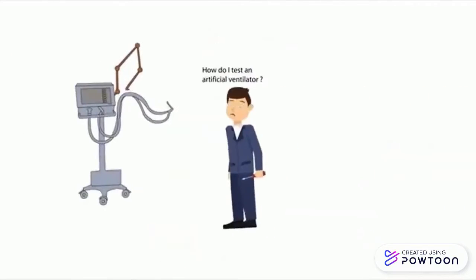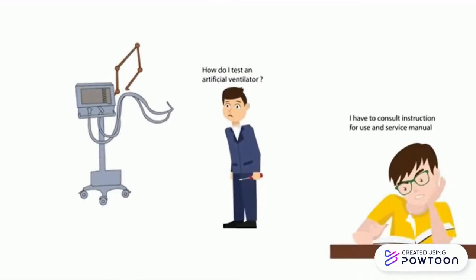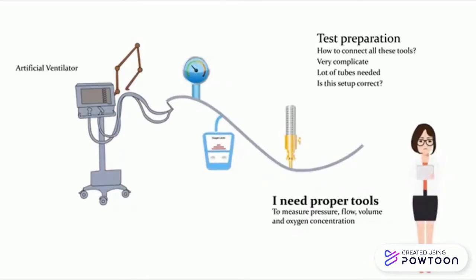All ventilators should be tested after each use to verify performance before the unit is used for another patient. Ideally, a verification based on the manufacturer's recommendations will be performed at each test. It takes about 2 hours and documentation is required at each step.